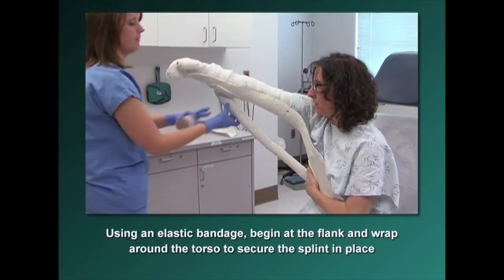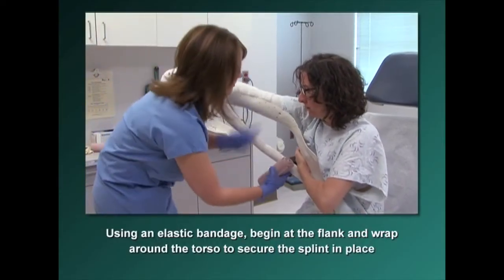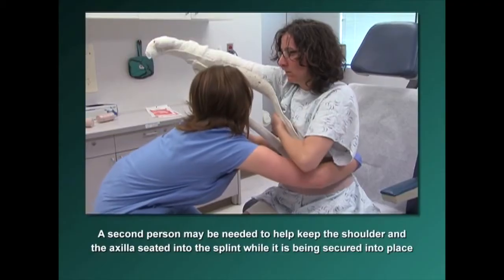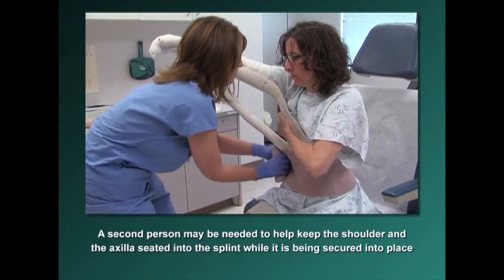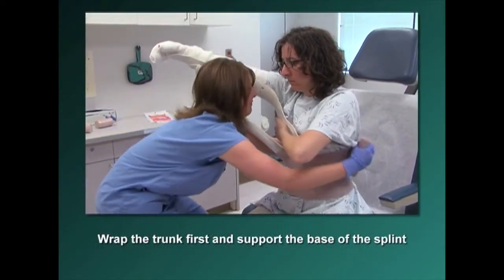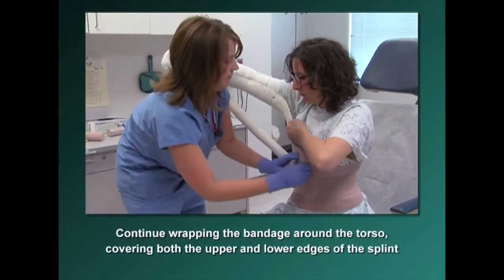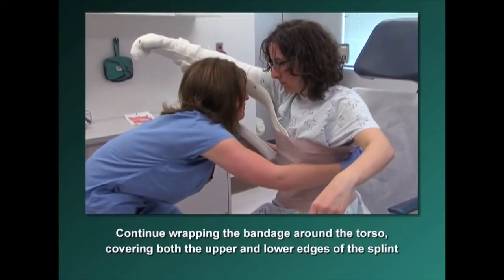Using an elastic bandage, begin to wrap at the flank and continue wrapping around the torso to secure the splint in place. A second person may be needed to assist with keeping the shoulder and axilla seated into the splint while it is being secured. Wrap the trunk first and support the base of the splint. Continue wrapping the elastic bandage around the torso, covering both the upper and lower edges of the splint to prevent slippage.